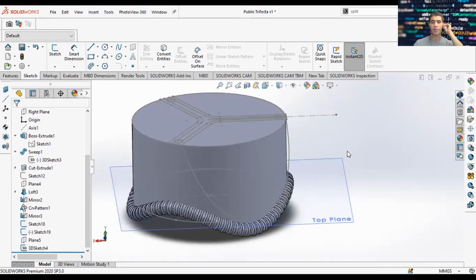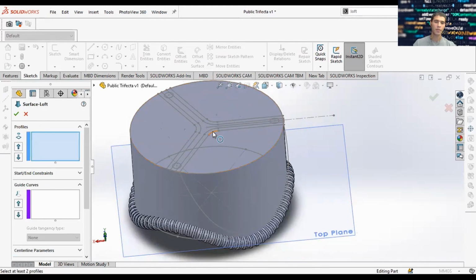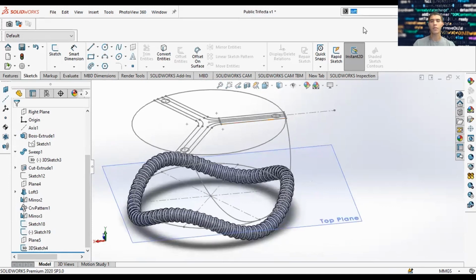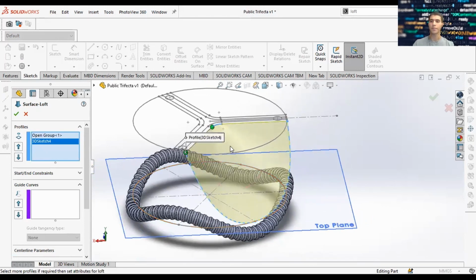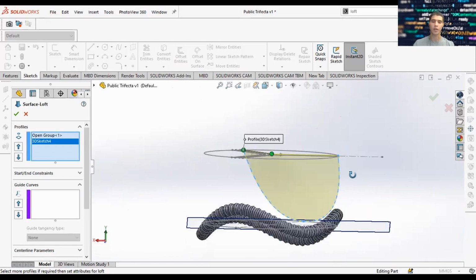So what do we have now? We have a surface spline right here. And we're going to make a surface loft, or lofted surface between this curve and the spline that we selected. To view this surface loft, let's actually hide this body. So now we just have our curve and our sketches. So we go here, loft, create lofted surface. And you'll notice the lofted surface is going to be connecting from our spline sketch to this sketch we have here for this fillet. So I'm trying to connect that as best as possible.